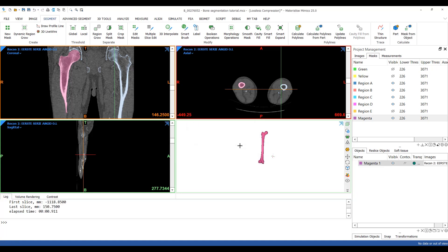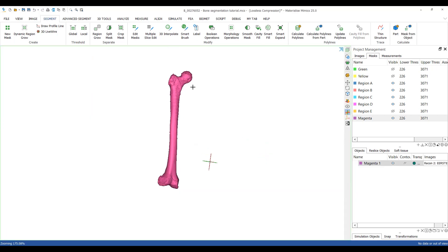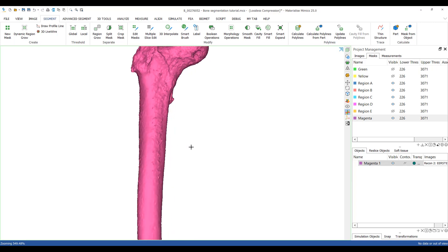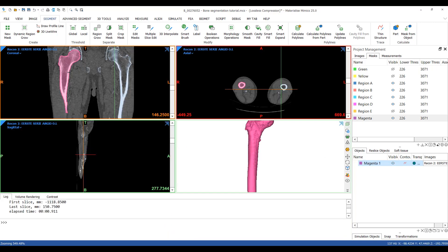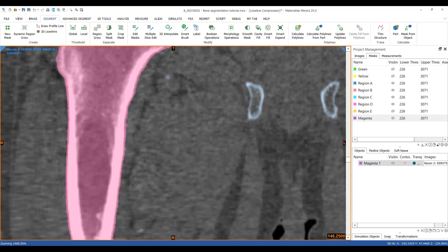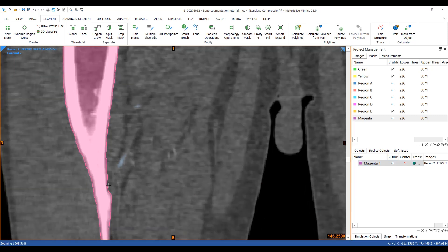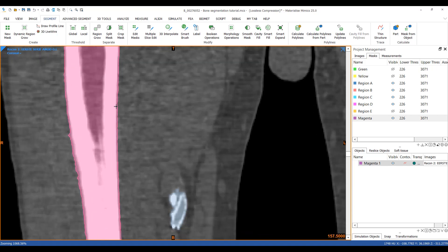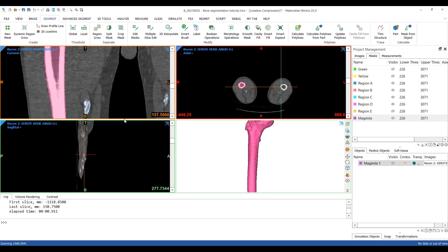By toggling on the 3D contours of my object I can verify the accuracy of my segmentation directly on the CT scan — and this is what the result looks like. Now I can use this 3D file to design a medical device, or for instance place landmarks and perform a 3D analysis in 3-matic. So that was the manual method.